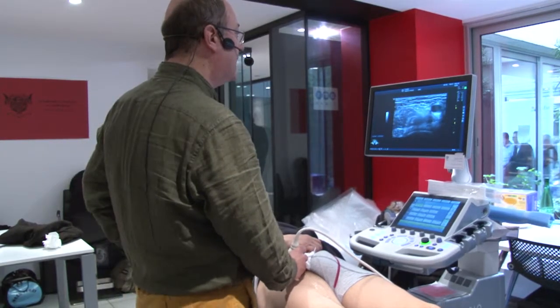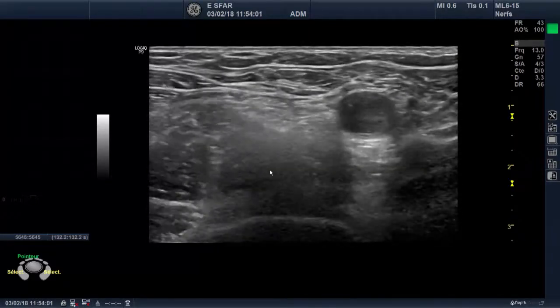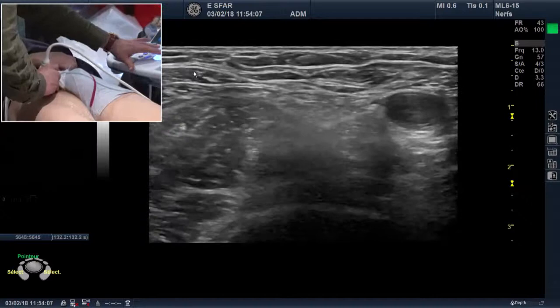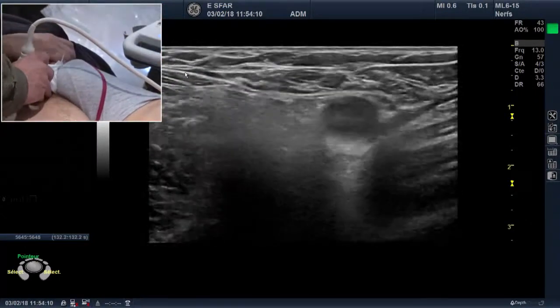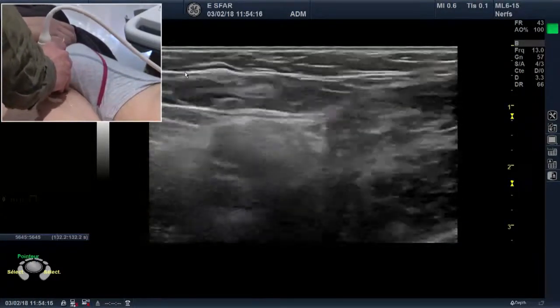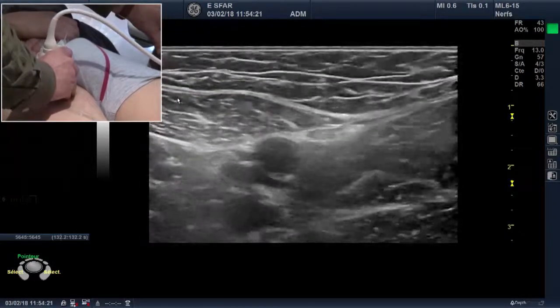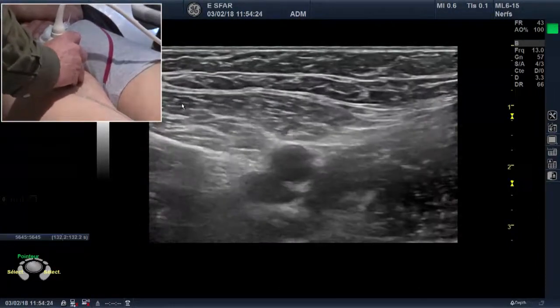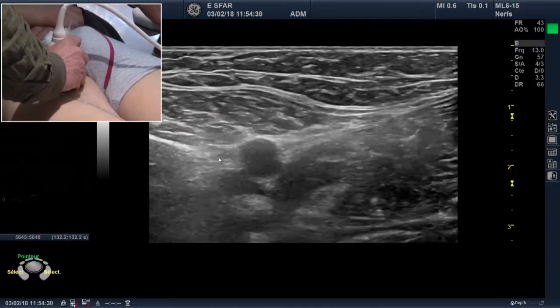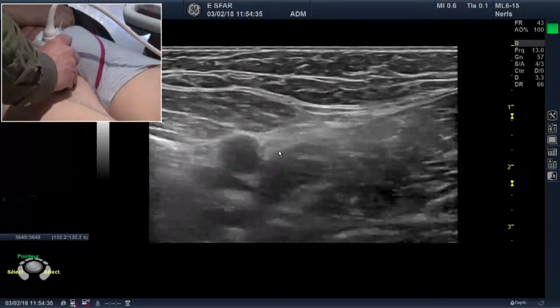Thank you. This is the slide that we have just been shown by our colleagues. You have the femoral artery that is located here. You have the femoral nerve, and most importantly here, you have the sartorius. When you move downside, progressively, you will have the sartorius going above the femoral artery. You see the femoral artery, you see the vein. We have most probably here the vastus medialis nerve, and here the saphenous nerve.